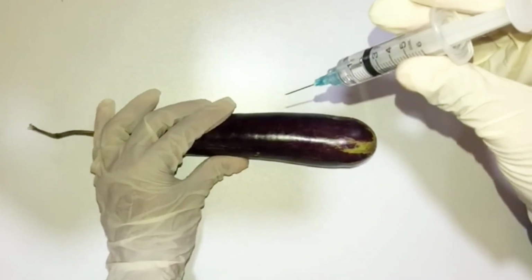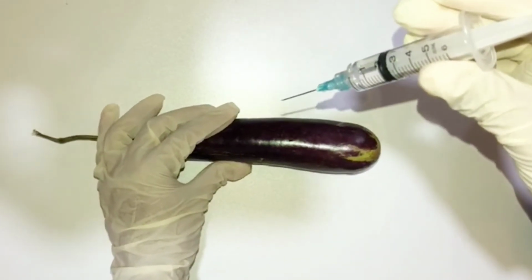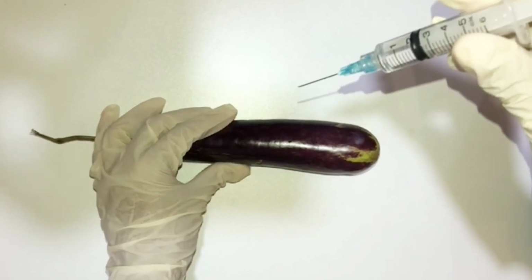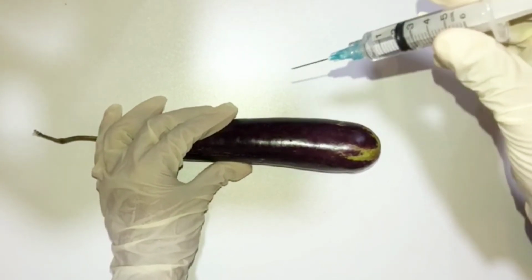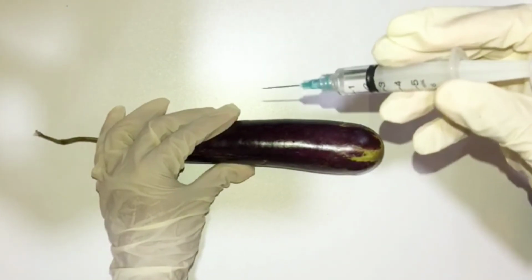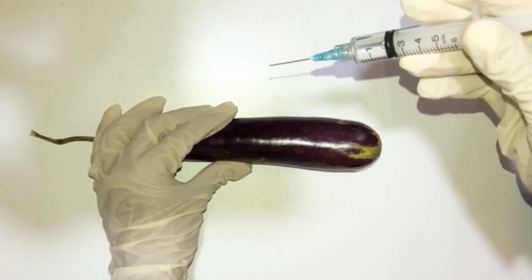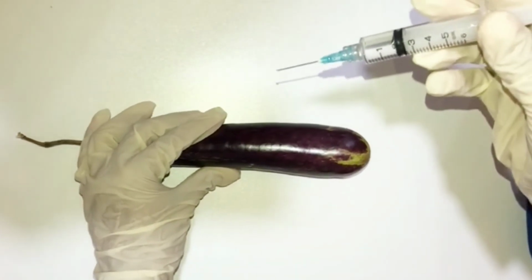Place the ulnar side of your non-dominant hand just below the injection site and pull the patient's skin laterally about 1 to 1.5 inches. Hold the position until you insert the needle. Continue to pull the skin taut with your non-dominant hand. Aspirate the syringe by pulling back the plunger with your dominant hand. If blood appears, find another site. If no blood appears, proceed.